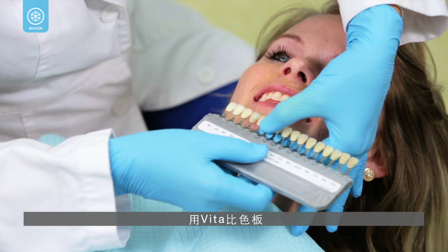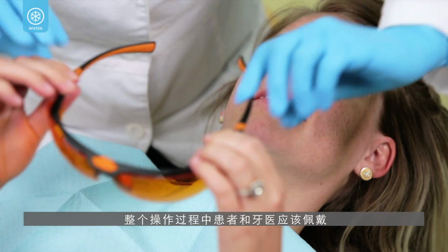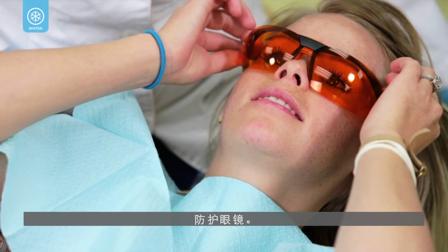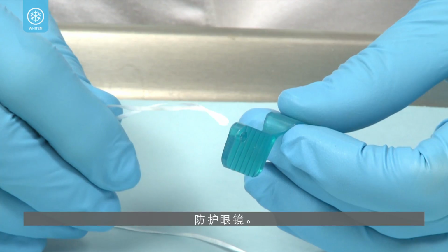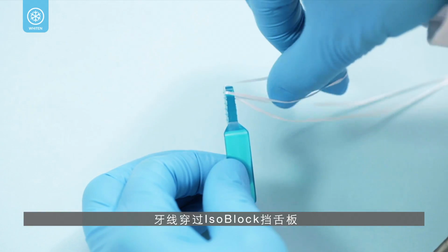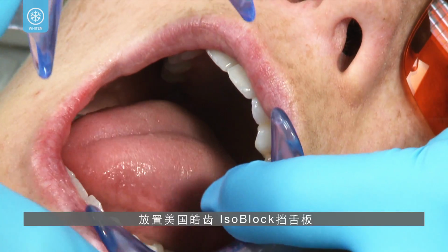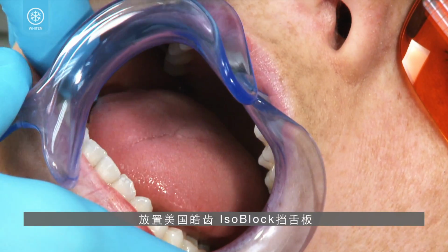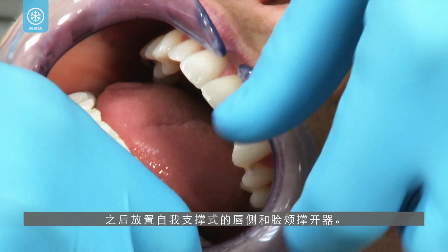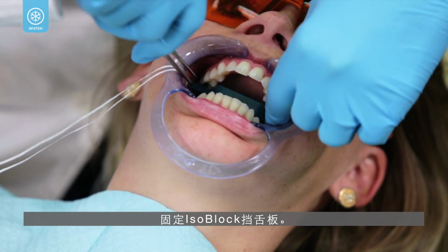Determine the patient's initial shade with a Vita shade guide for your records. Both the patient and the dental professional should use protective eyewear throughout the procedure. For added security, tie a length of dental floss through one of the holes in the ISO block to prevent accidental swallowing. Place a self-supporting lip and cheek retractor followed by the Ultradent ISO block. Instruct the patient to hold the ISO block in place with gentle but firm biting pressure.